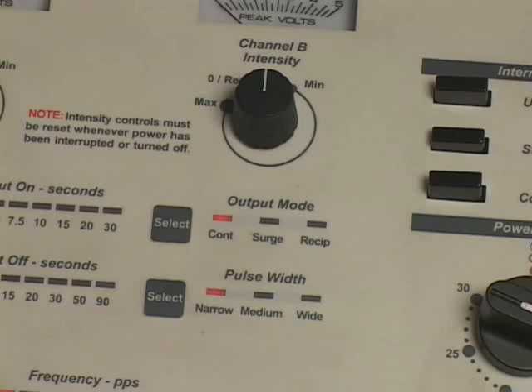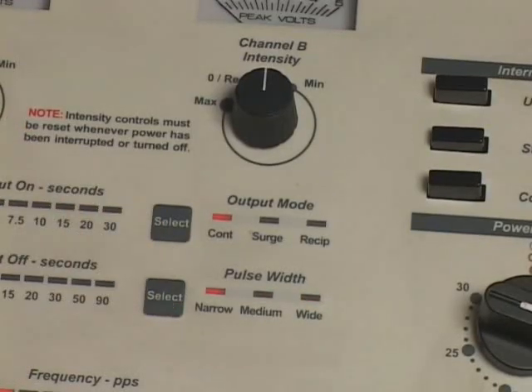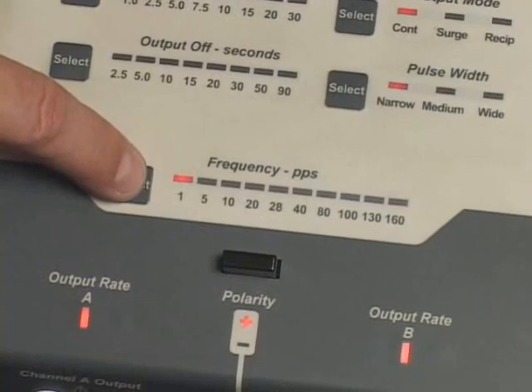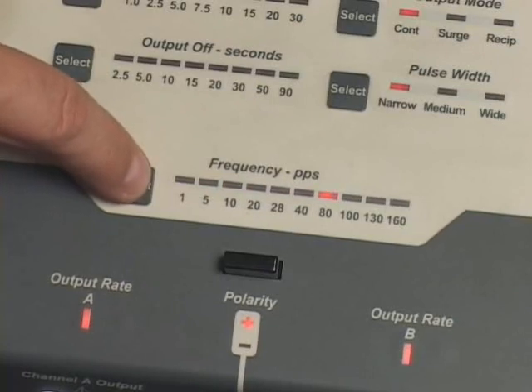This will prevent unexpected surges of intensity during the initial patient setup in surge or reciprocal modes. Press and release the pulse width control until the desired pulse width is selected. The pulse width control can only be adjusted when the channel A and channel B intensity controls are set to the zero reset position. Press and release the frequency control until the desired pulse frequency is selected. The frequency indicator light array indicates the pulse frequency selected.